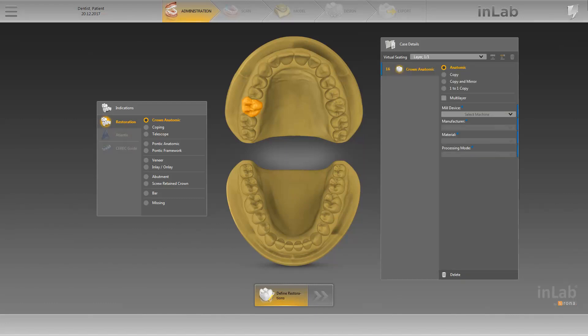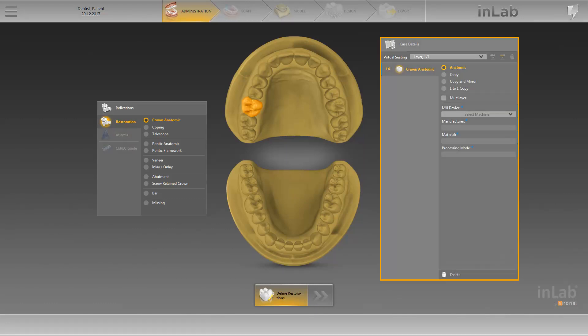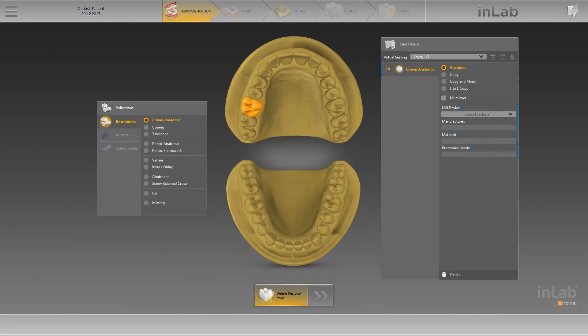The restoration appears immediately in the case details window. If necessary, you can change the anatomic design mode here. Specify the mill device, the manufacturer, the material, and, if prompted, the processing mode. Mandatory fields are marked with a blue asterisk, as well as a blue indicator on the right-hand edge.